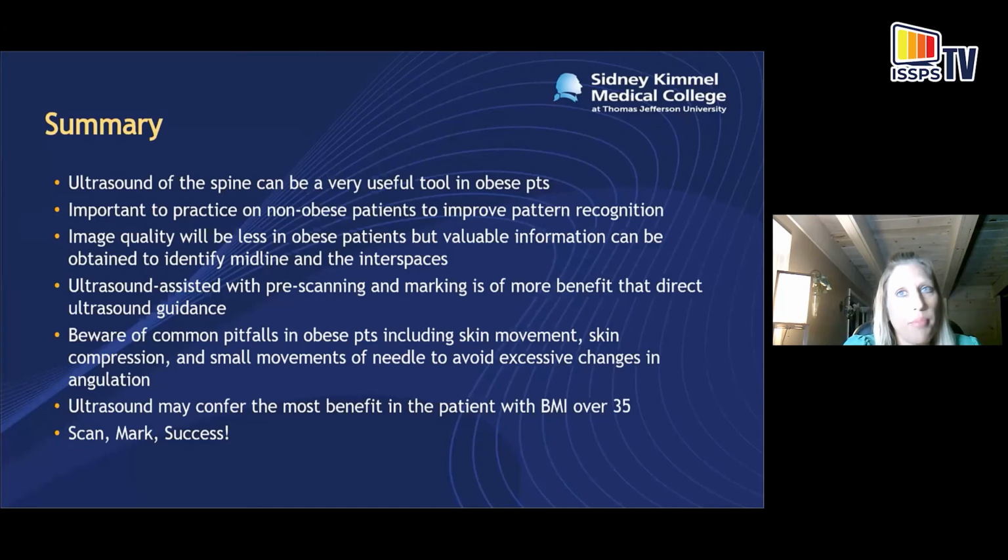And beware of the common pitfalls such as skin movement, skin compression, and small movements of the needle to avoid excessive angulation changes. Ultrasound may confer the most benefit in the patient with a BMI over 35. But that's just from a small study, and it had very interesting results. And I always say, scan and make sure you're marking, and then you'll have good success.